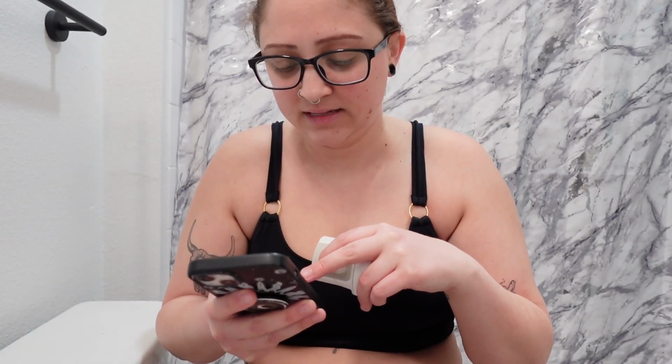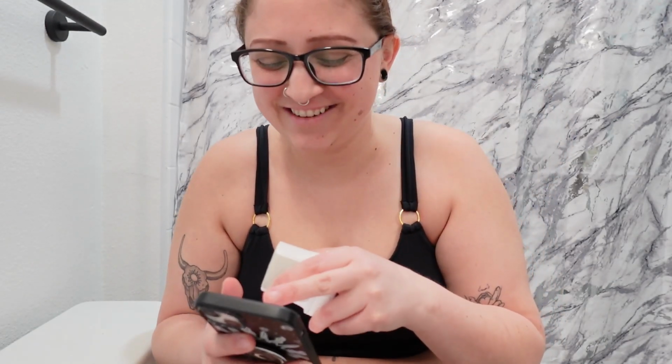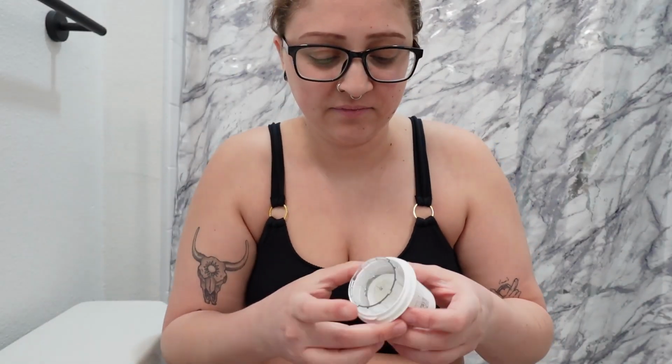So let's open the G7 app, and I can't wait for it to yell at me. I knew it was because it was like, start your new sensor, let's go. It's been past the grace period, so I was waiting for it. All right, so I went ahead and I scanned the sensor, and now it's asking me to insert. We'll just pop, lock, and drop it. Literally, that's all it took. Okay.